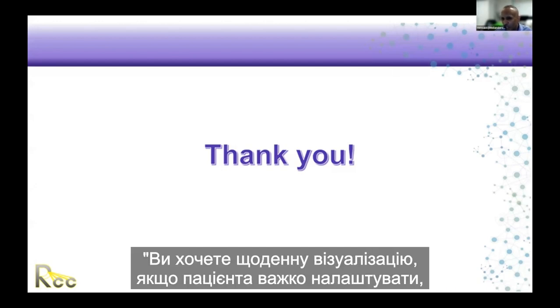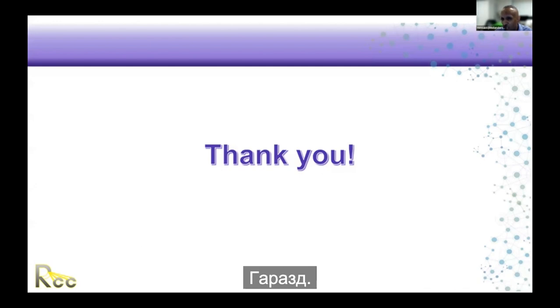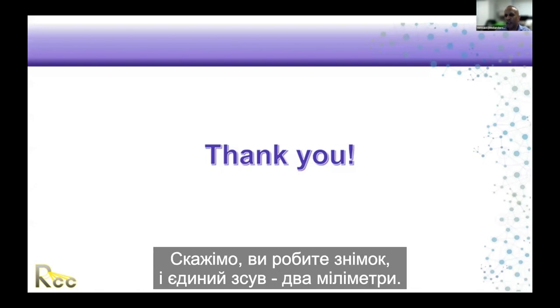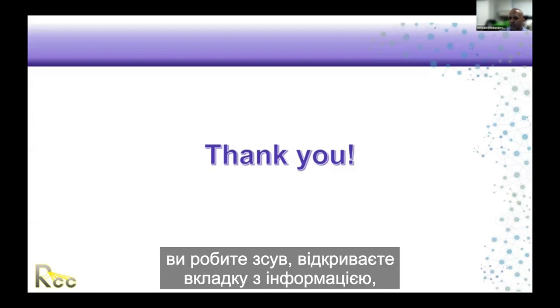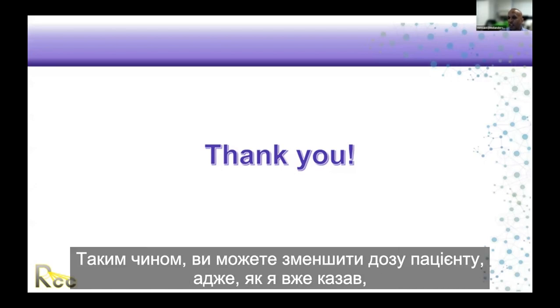If the patient is hard to set up, and the field is so small, there's no other choice. Second, it depends. Do we have a policy to image post-shift? Let's say you take an image and your only shift is 2 millimeters. Are you required to take an image after the shift? Or can you just make your shift, type the information, patient moved 2 millimeters left or right? That way you can save the patient, like I said, every photon counts.